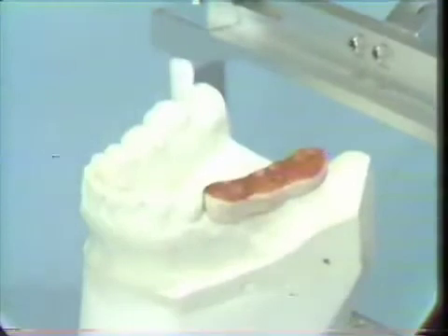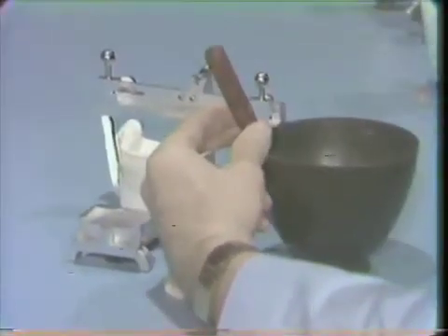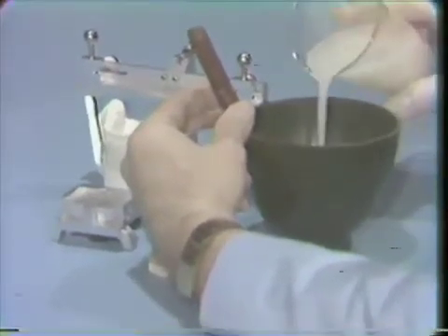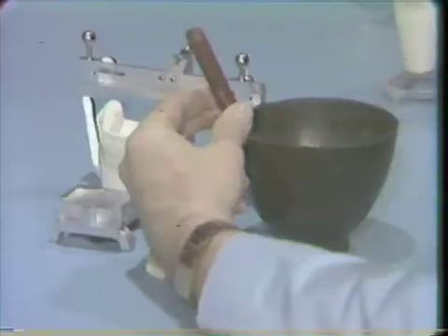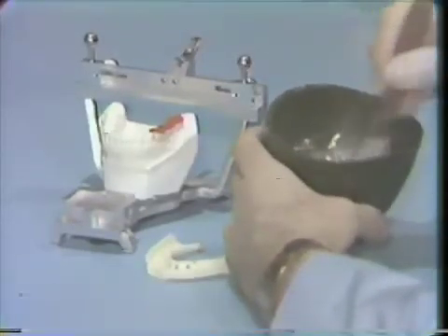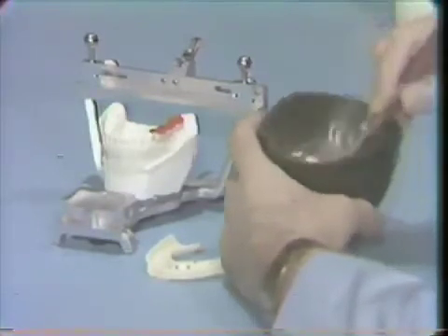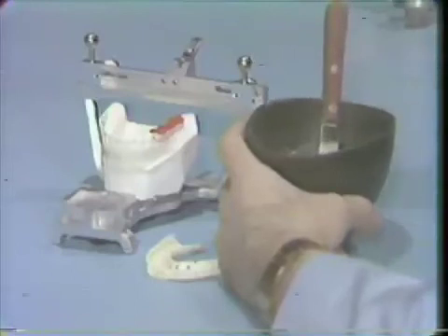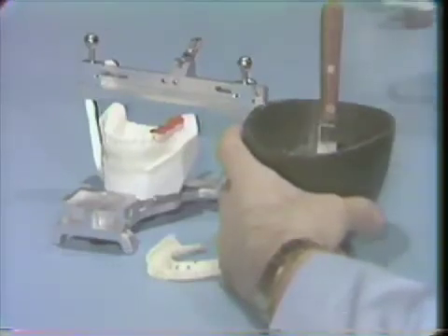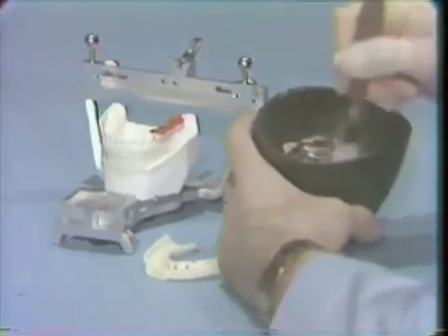We're going to use a material called Gray Rock stone, and this sets quite rapidly. Unfortunately, some of these quick-set stones, after they've been on a shelf for a period of time, lose some of the quick-setting properties, so that it is necessary, as we use this material up, to use either slurry water, which we're using in this particular instance, or warm tap water.